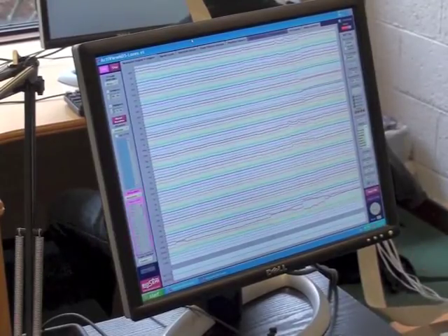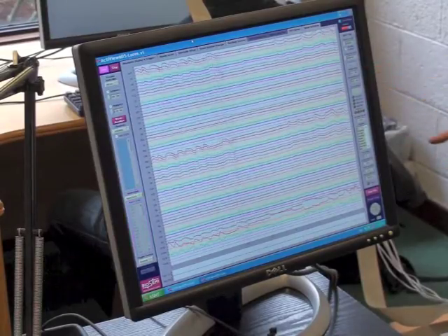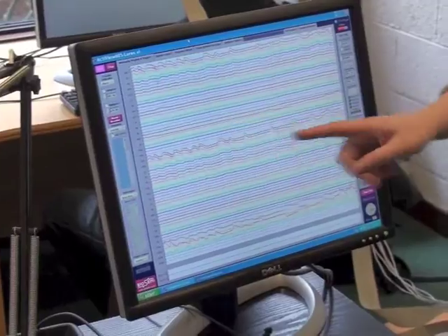So blink again there, Brenda, a few times. You see the blinks there? So obviously all those trials are way too noisy.